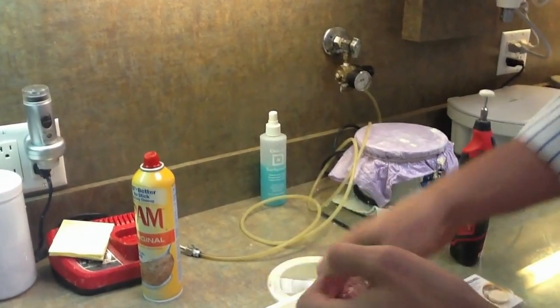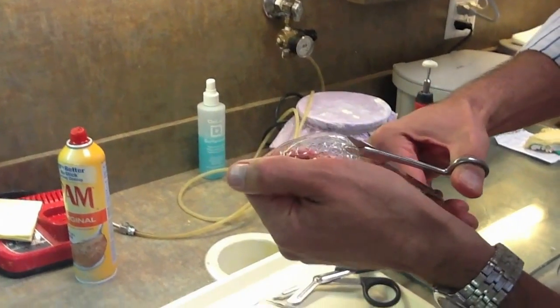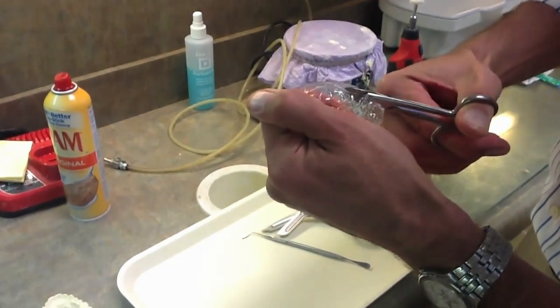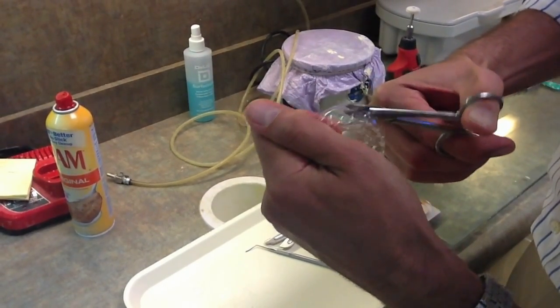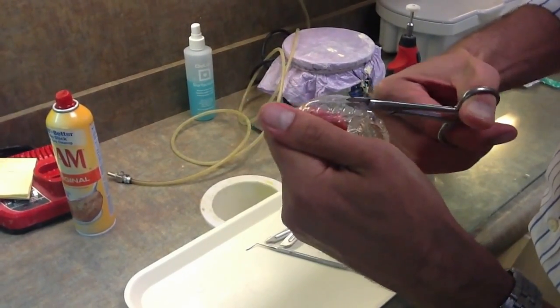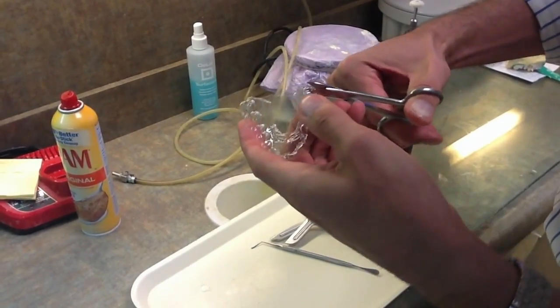The next step is to go around the periphery of the model. We usually cut about two millimeters below the gingiva, and we've found that scalloping is just not necessary.